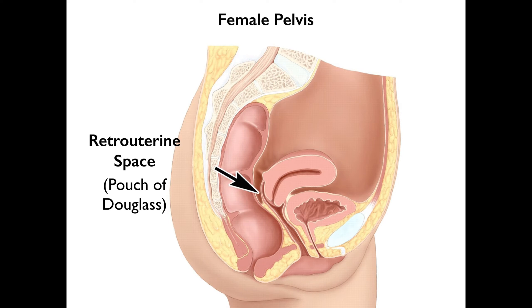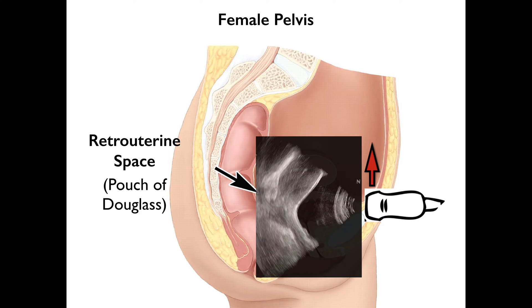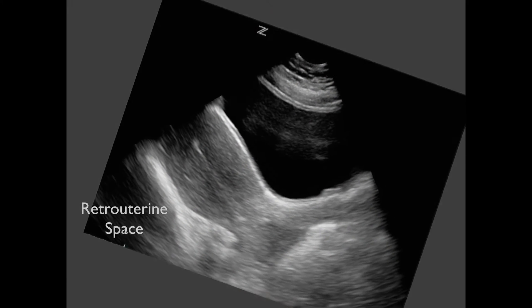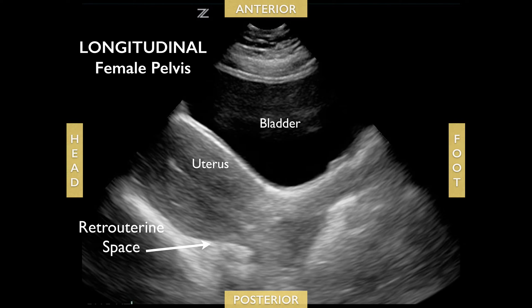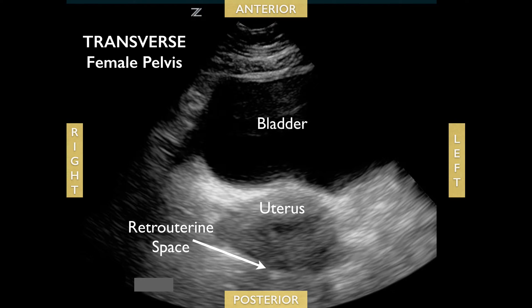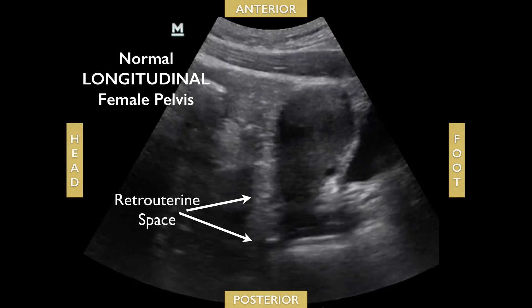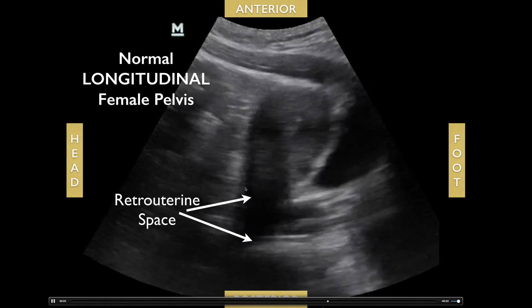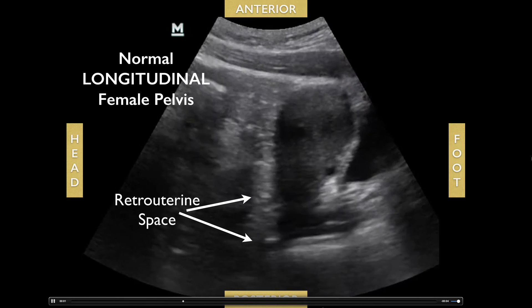For females, you're going to look at the retro-uterine space or the pouch of Douglas. With the indicator towards the patient's head for the longitudinal view, you'll see the bladder and uterus. Focus on that retro-uterine space posterior to the uterus. In a transverse view you look for fluid right behind or underneath the uterus. This is a normal patient with no free fluid.